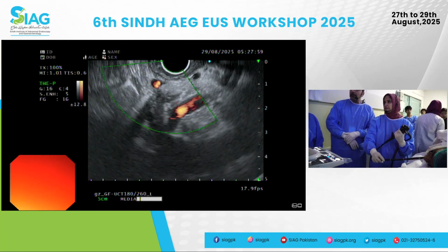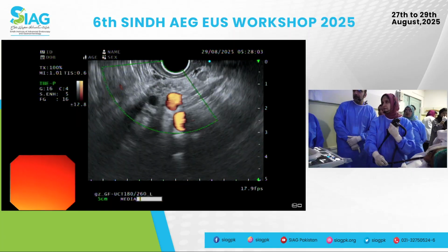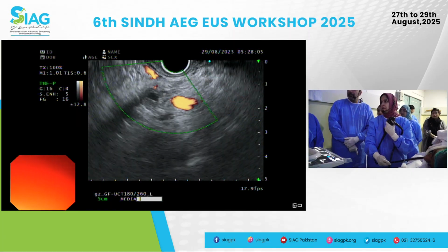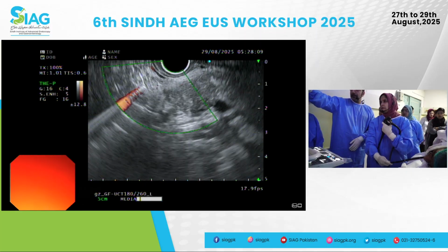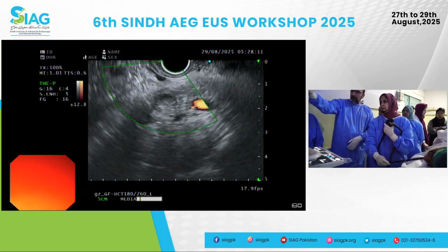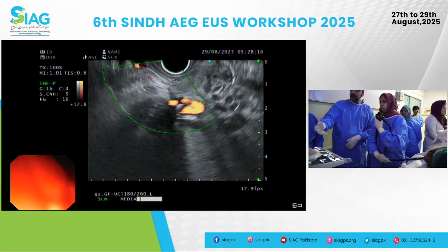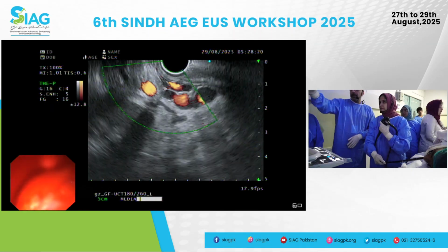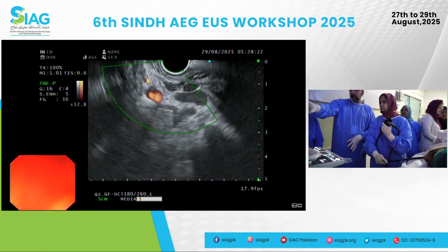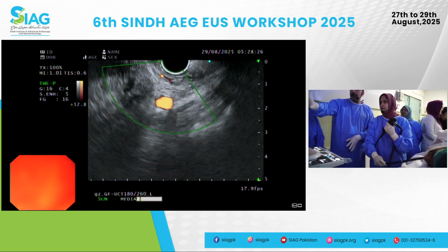Okay, so go ahead and go back towards the splenic hilum, and let's just see. The other thing we can do here is you know that you have pancreas, right? So pull back, show us the splenic vessels here. Pull back where you would expect to see the splenic vessels. Okay, good. Now go counterclockwise. So stay on the pancreas for a second.